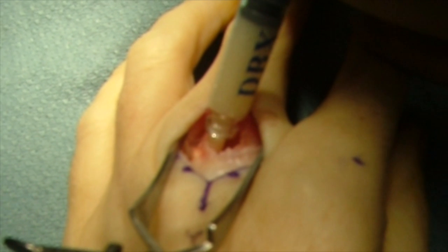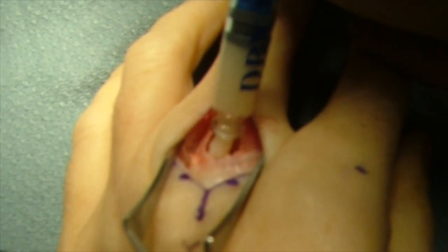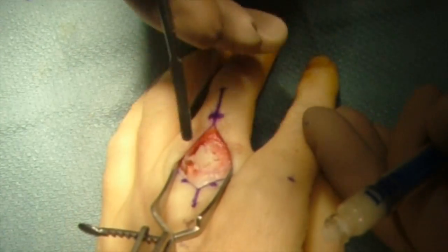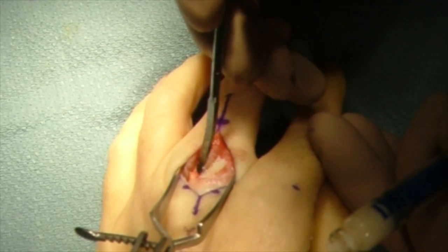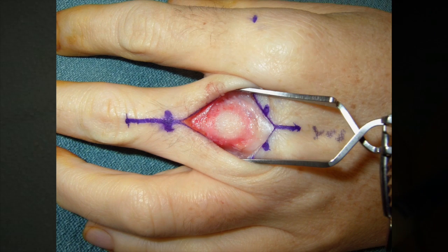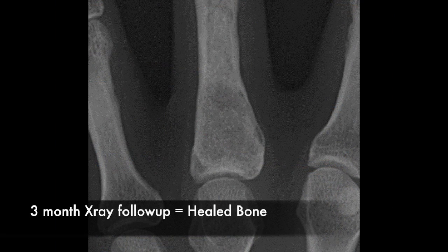Here I'm filling the enchondroma cavity with demineralized bone matrix, and this will serve to allow the bone to reheal in this area. And here I'm packing in the demineralized bone within the enchondroma cavity, and here it's completely filled. And then after a few months, the bone heals back and the enchondroma is completely repaired and healed.